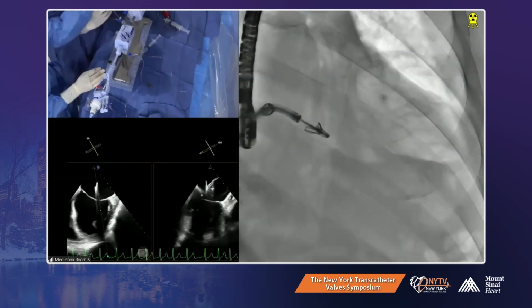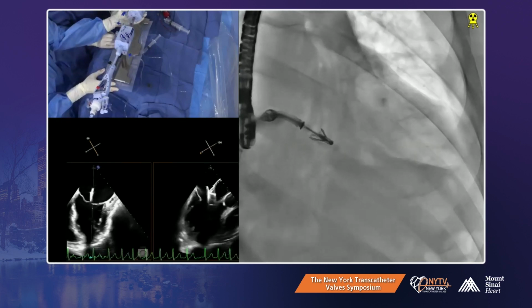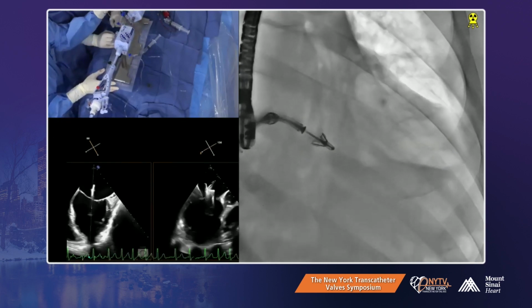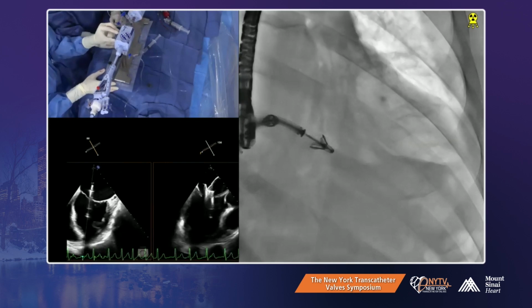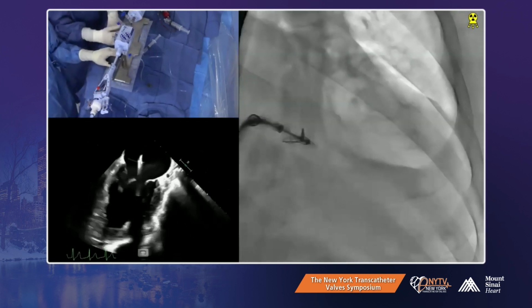Don't put too much plus. I think plus is against us, but when you have a septal hugger, you go to 0. Please. Okay.